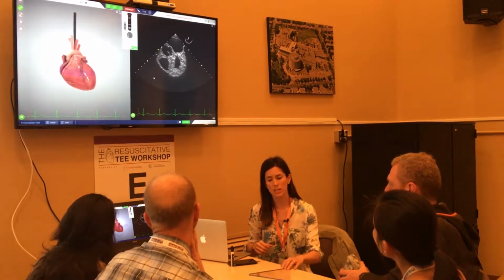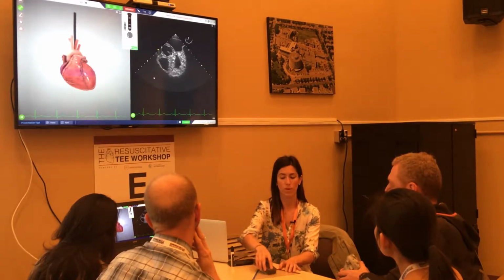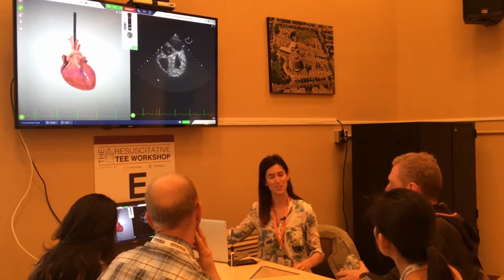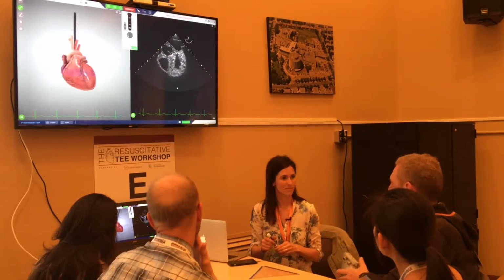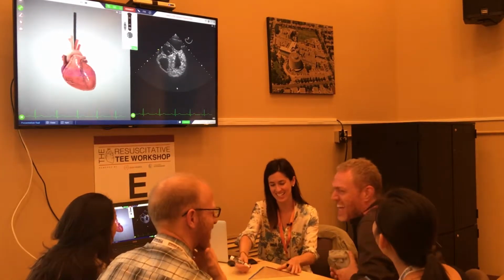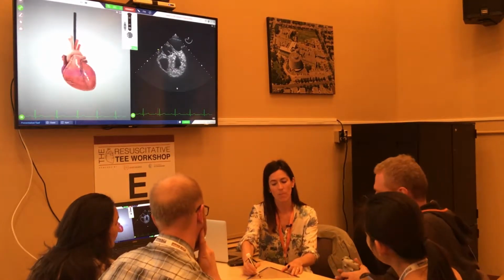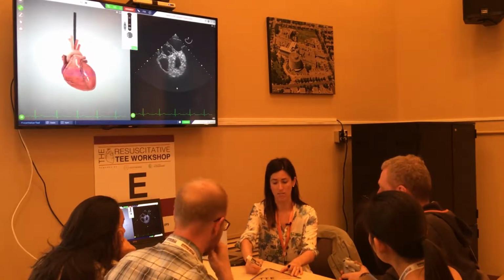Okay? What is the next valve that we're going to see? We have 2 more, so it's a 50-50 chance. Mitral valve. Mitral valve. Excellent. It looks close together. Yes, yes. Okay, so a lot of us are used to using transthoracic echo, right?